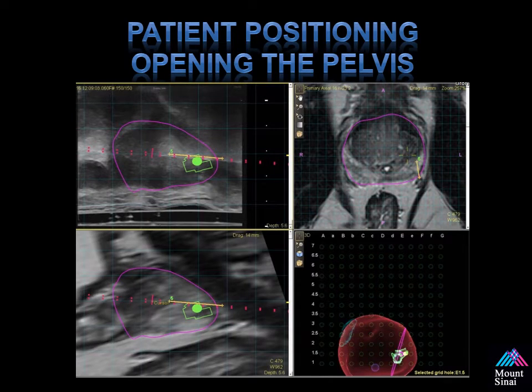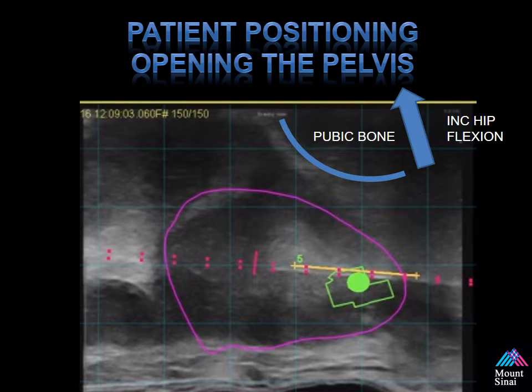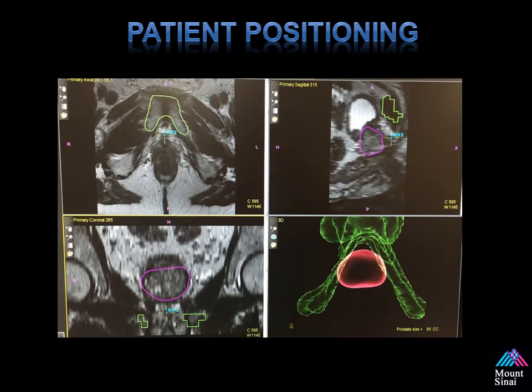With any new technique, it's important to understand that you may have to open the pelvis. Looking at this orientation, you can see the ultrasound probe inserted, the rectal wall, and the prostate in the upper left-hand corner of the screen. What's important is to look at the pubic bone. By increasing the hip flexion, you're able to move the pubic bone up and away from the prostate, allowing you to sample the anterior portion of the prostate. When starting off, if you're having difficulty locating the pubic bone in relation to the prostate, you can highlight and segment this area in Dynacad and treat it as a target on the Euronav to see what areas you can reach, as well as determine the best path to get your needle to target.